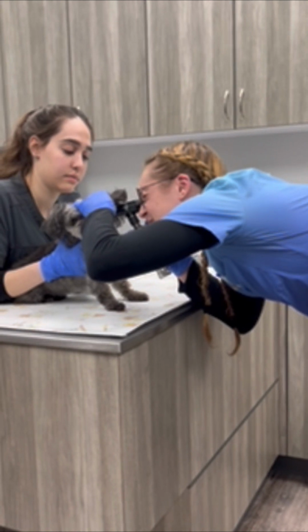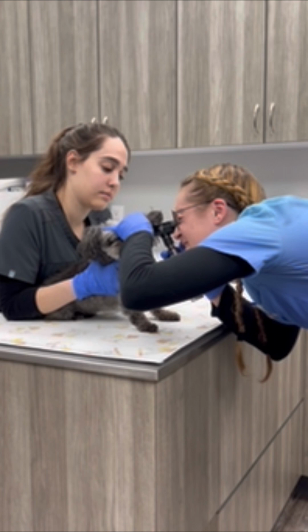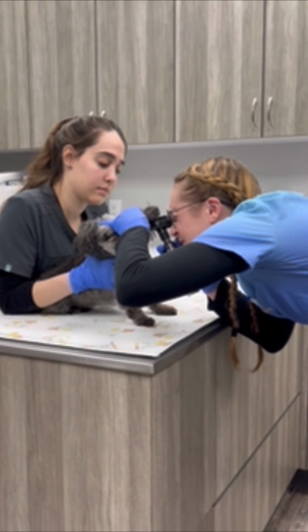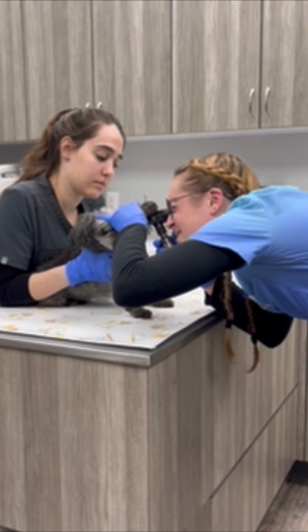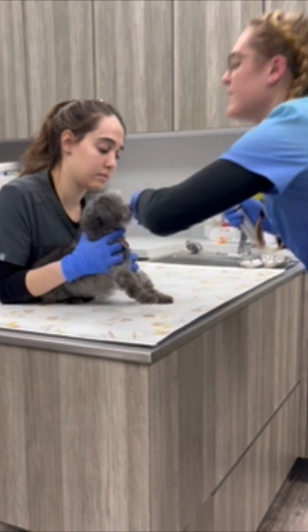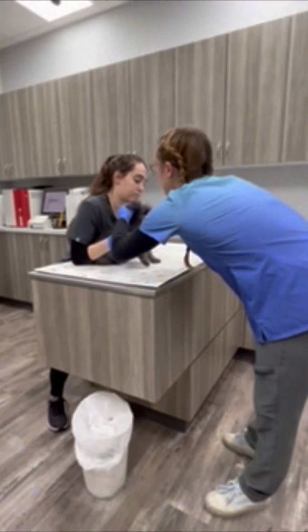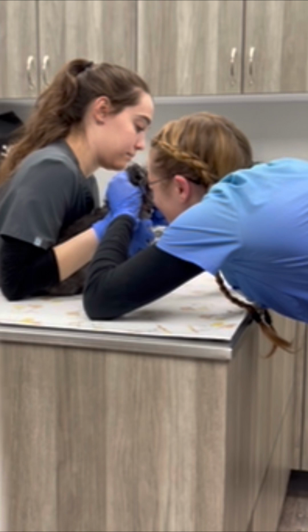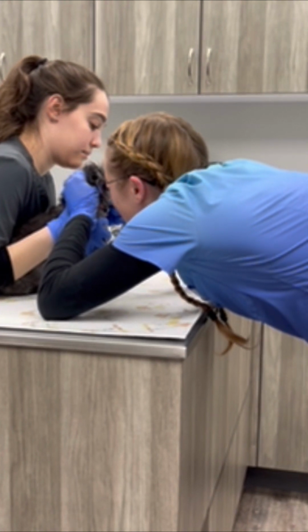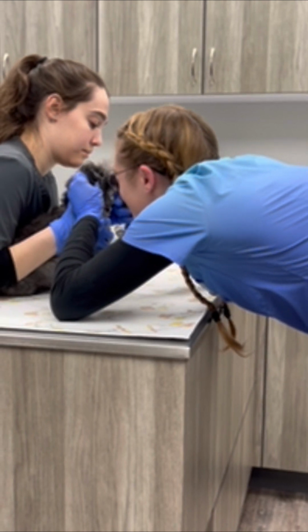I have full visualization of the tympanic membrane, which appears a light pink color, and there is no fluid or discharge buildup or any other abnormalities upon assessment. Moving on to the patient's right ear, I'll be repeating the process again. Again, I have full visualization of the tympanic membrane, and there are no abnormalities present upon physical assessment.